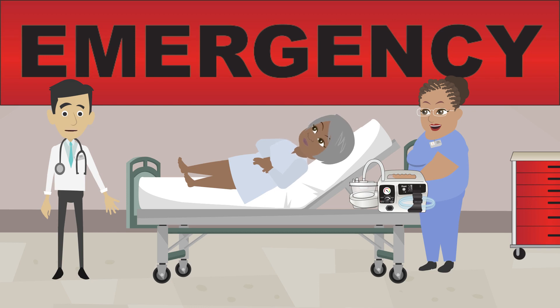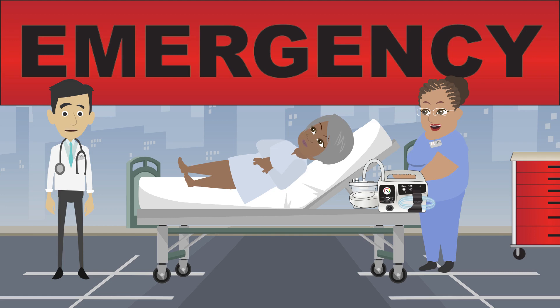The Duet can be easily carried to waiting rooms or hallways within the hospital, as well as triage areas outside the hospital — wherever suction is needed.